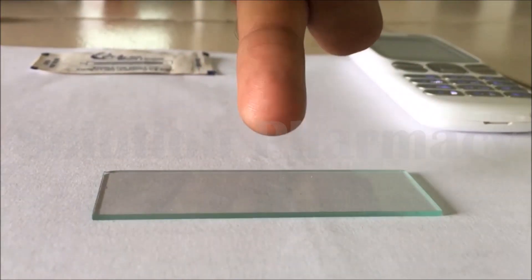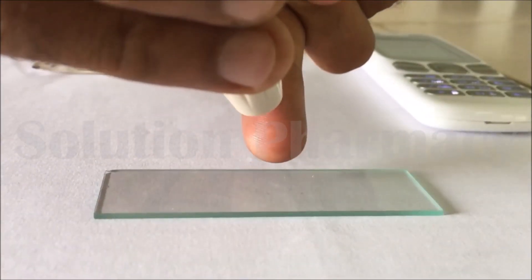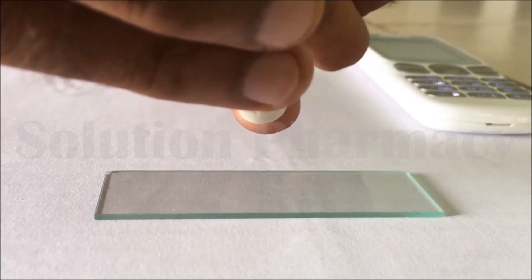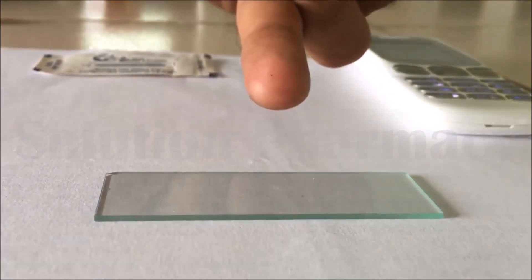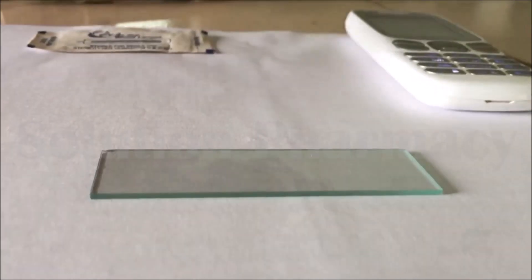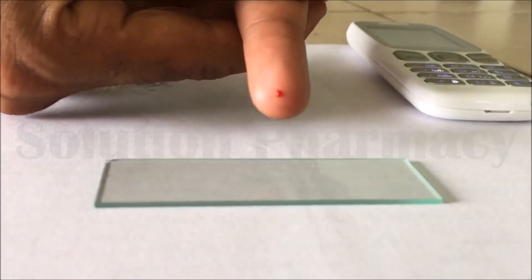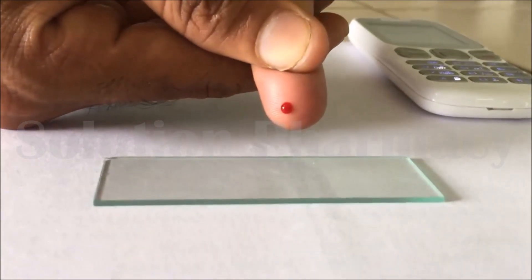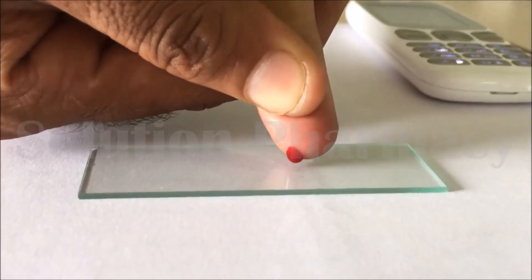After sterilizing fingertip, prick the fingertip with the help of pricker pen which has lancet inside it. After pricking, we will obtain free flowing blood. Immediately pour this blood drop on the slide and start the stopwatch. Note the time.